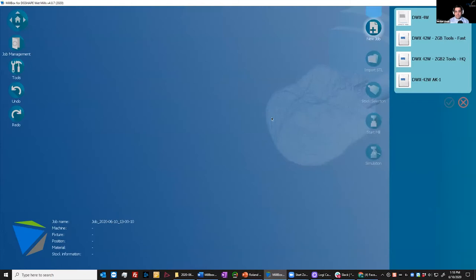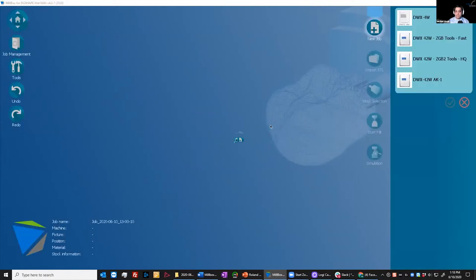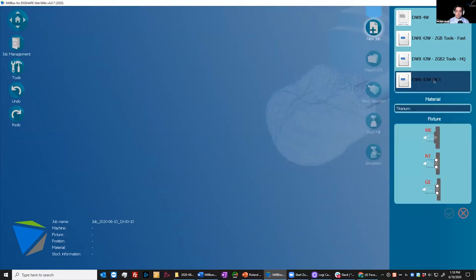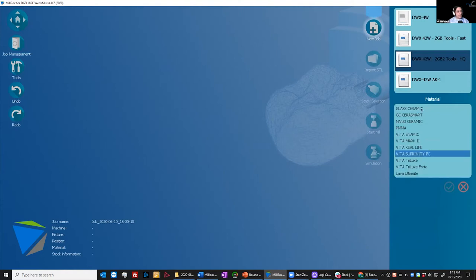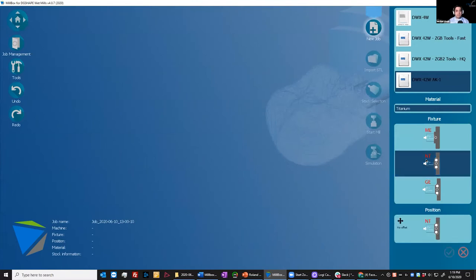Let me switch over to Millbox and get started on the workflow. This is the Millbox CAM interface. I'm faced with three separate icons here. We're strictly going to focus on the AK1 kit and its workflow, so I'm going to start by selecting my new job. Once I've selected my new job, I'm going to go over to the right and see the DWX42W AK1 kit labeled. I'm going to select this particular machine so that I have the titanium material available. Then I'm also going to select the pre-milled blank type — in this example, we're going to be using the NT Trading platform with a file designed using the NT Trading library from ExoCAD. Millbox automatically pulled in and loaded the DWX42W fixture along with the NT Trading adapter and pre-milled blank adapter.